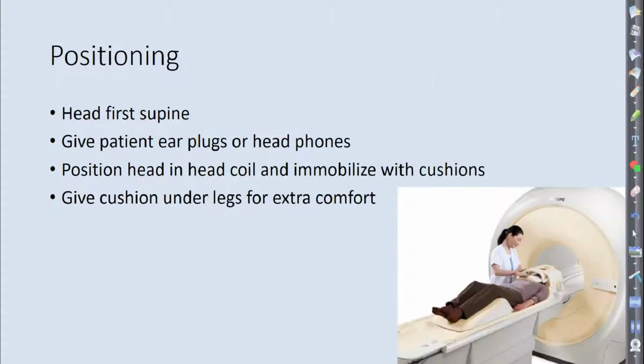questions. All right, positioning-wise, we saw in the video, head first supine. There's really no other way to do a brain. So if they can't lay on their back for 30 minutes, it's going to be tough for them. I've had patients where they're so kyphotic, we tried to boost up their legs, but there was just no way we could fit their head into that head coil.